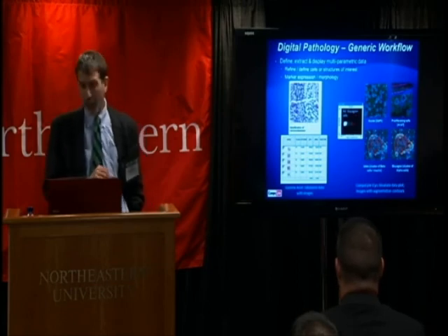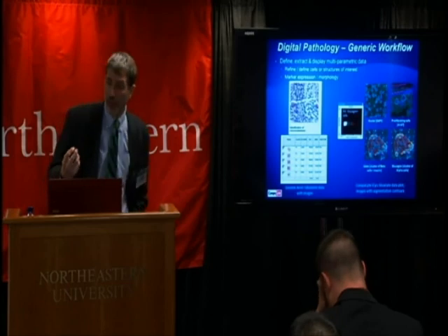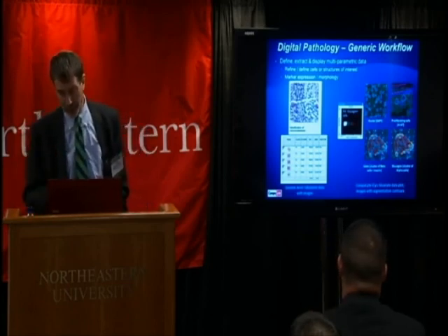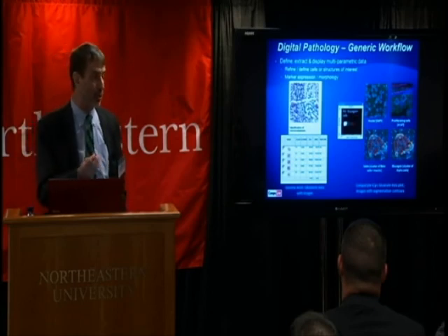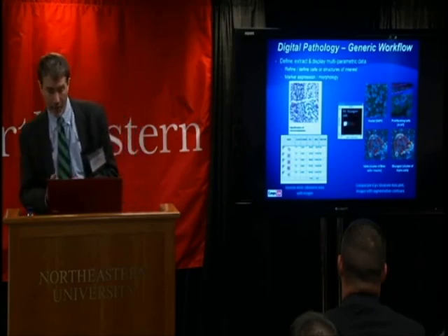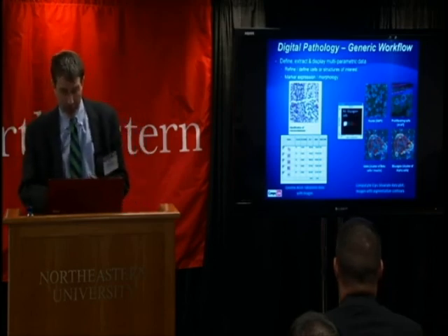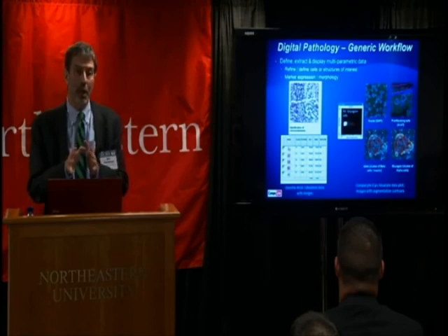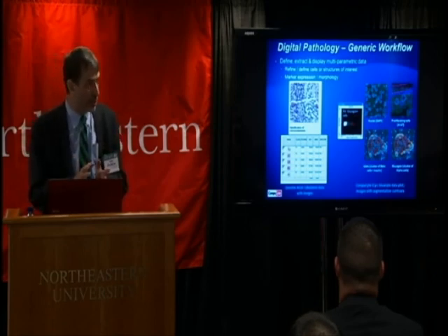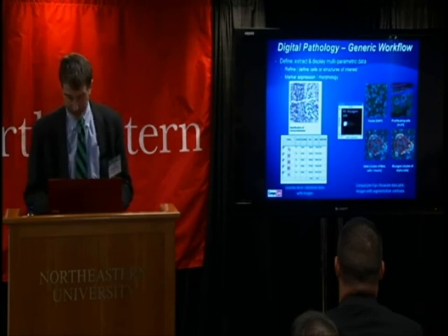On the right, I show 4 different types of contouring of different antigens based on different criteria done simultaneously, and then that data is displayed in a scattergram. The scattergram portrays the flow cytometric origin of this system, the ISIS, where one can then isolate or identify and segregate populations of interest based on the bivariate plots or a series of bivariate plots.